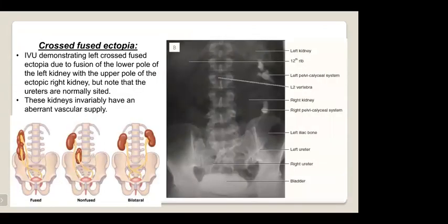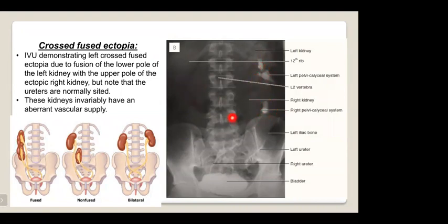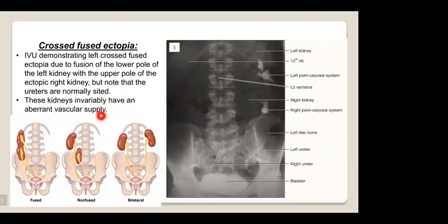Cross-fused ectopia is a congenital anomaly where one kidney has crossed to the other side and may be fused with the opposite, normally sited kidney. On IVU, the right kidney can be seen crossed to the left side and fused with the left one. Note that the ureters are still normally sited. These kidneys invariably have an aberrant vascular supply.